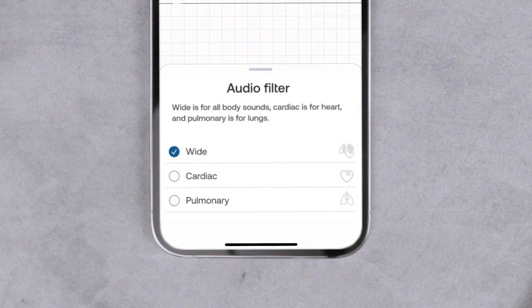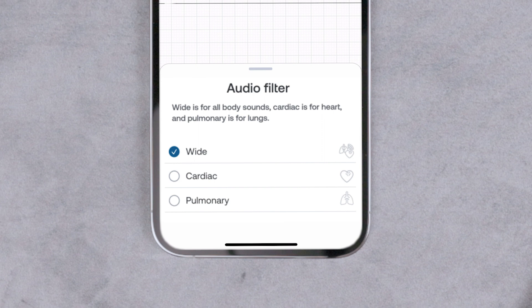Tap the audio filter icon to change the filter. You can choose between cardiac, pulmonary, and wide. Wide is for all use cases. We recommend using the wide filter first because it has the widest bandwidth for all body sounds. Then the cardiac and pulmonary filters can be selected to focus on specific sounds for those use cases.